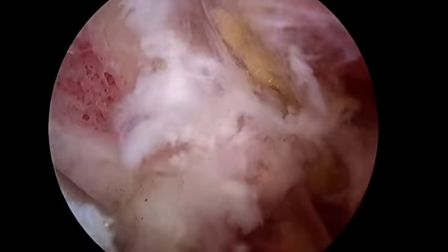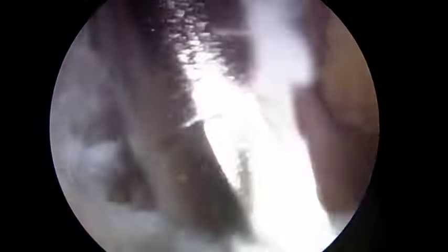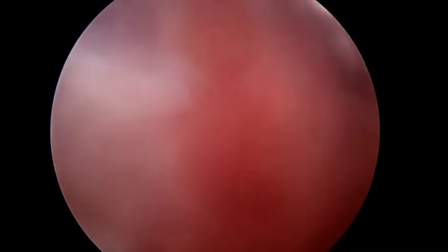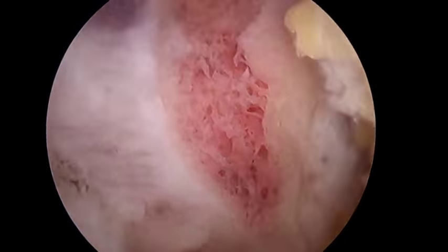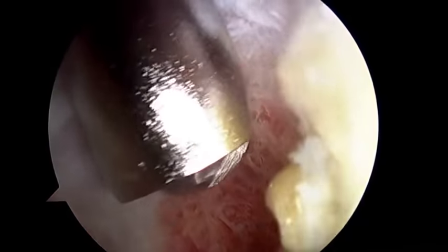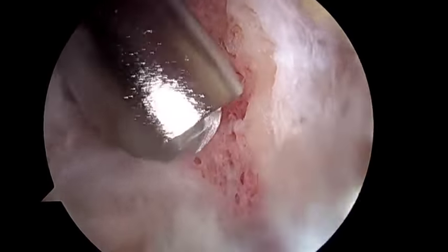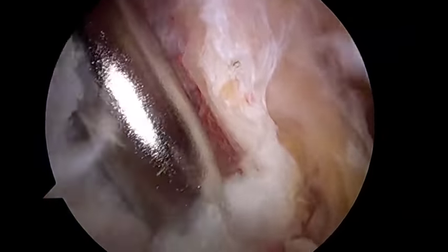We're just cleaning up some of the soft tissue, trying to get control of what we call hemostasis, which is a fancy word for bleeding. Okay, so we've identified the entire clavicle, and we're a little bit upside down. This is the undersurface of the clavicle here. This is actually the top side. So, again, just finishing off the end of the clavicle. And the idea is we typically take about a centimeter off the end of the clavicle when we do that procedure.